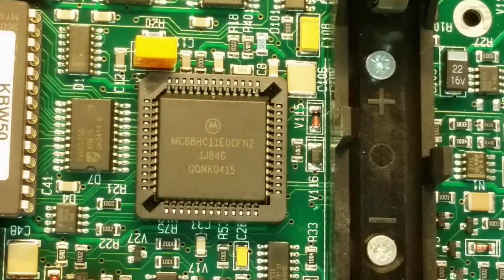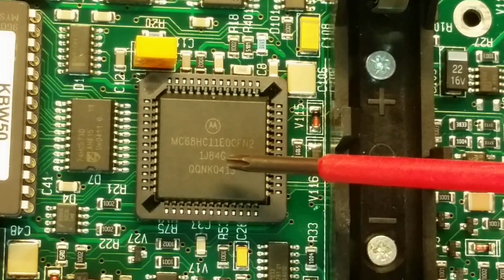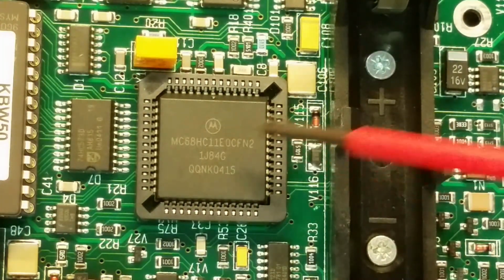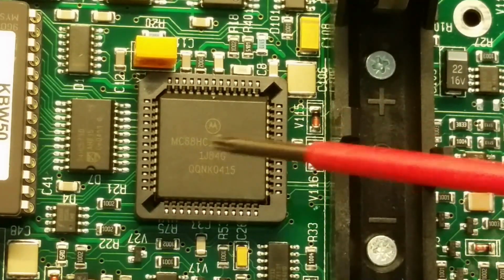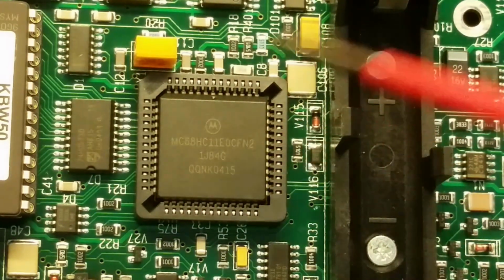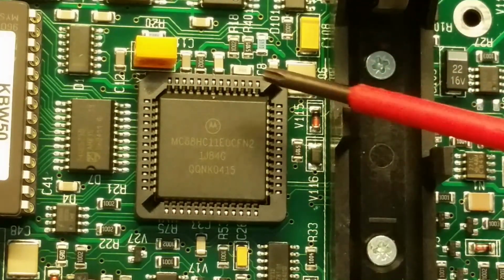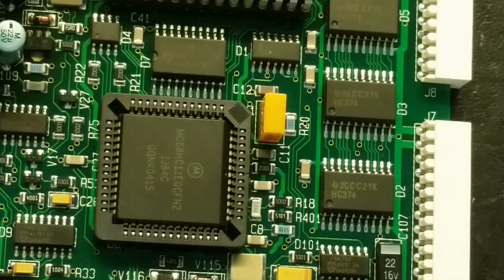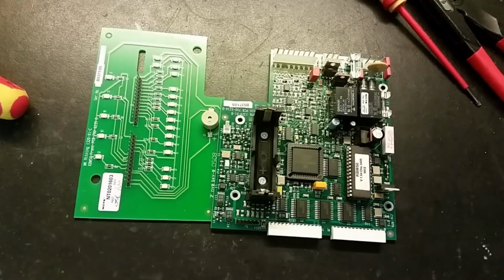Here we've got the main chip. We've got this long number here, 1J84G, and I could hardly find any data sheet for that. I think it's maybe some kind of 4-bit, not so fast processor with built-in crystal, because I don't see any crystals around it. How could I miss the crystal? It's right here. It's a 455 kilohertz crystal. I think we're ready with this unit here.